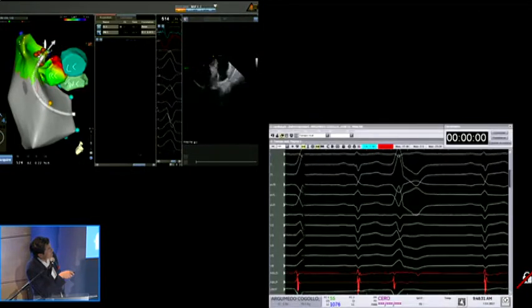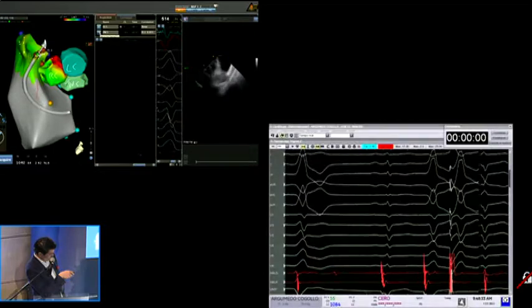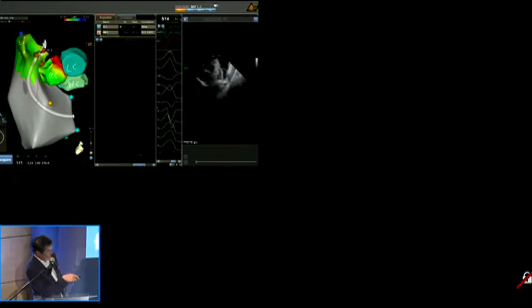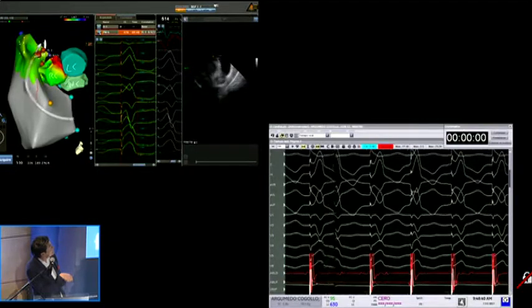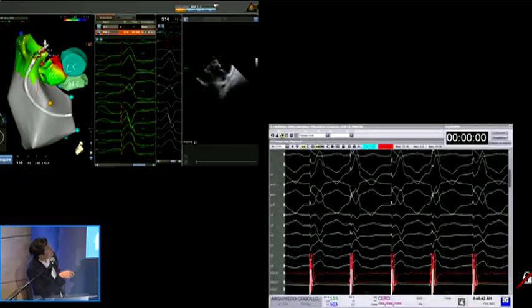Are you ready to take it? Please stimulate, Marcela, pace. Is it capturing? Yes, that's it. That's the one.